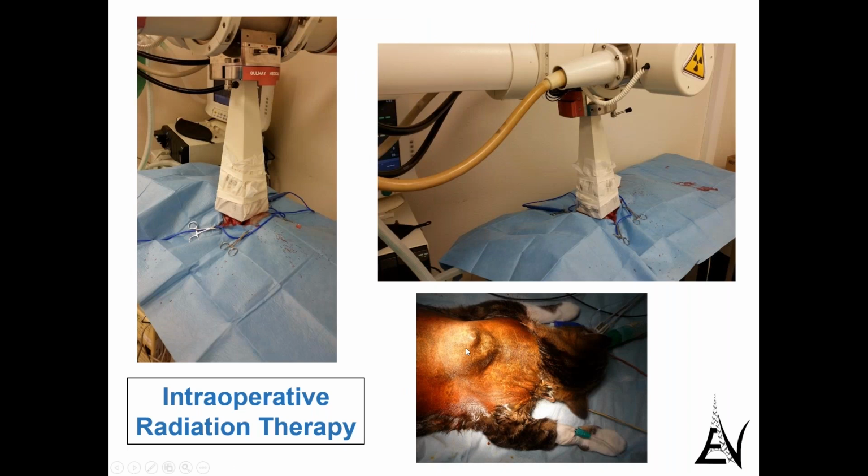So that's the cat with a fibrosarcoma. And this is the cat underneath the sheet. Basically, the procedure at Eiffelvet with our team, we're now well trained all together, the nurses, the surgeon, the radiotherapist, the oncologist. So it's a procedure altogether that takes us 2 hours. So it's just one surgery, one radiation, 2 hours. Not that bad.